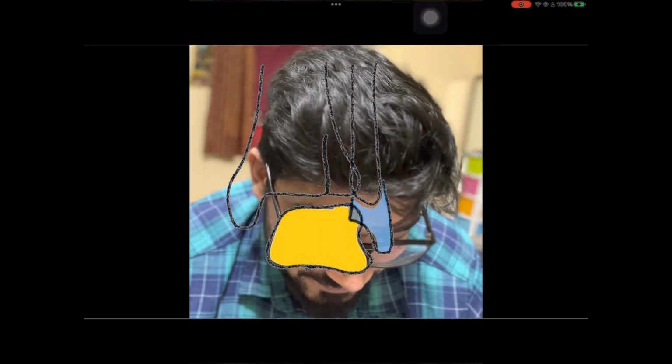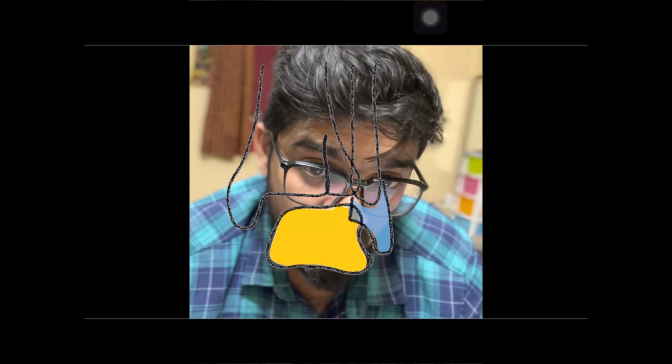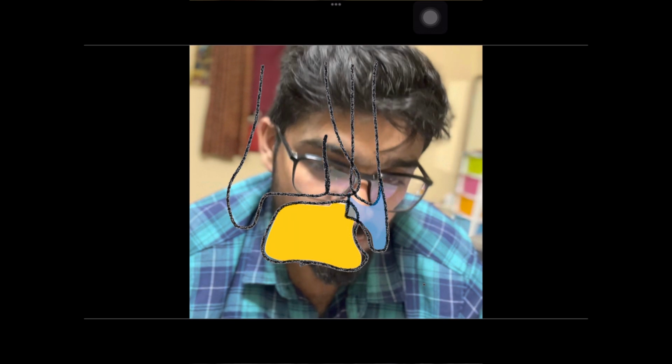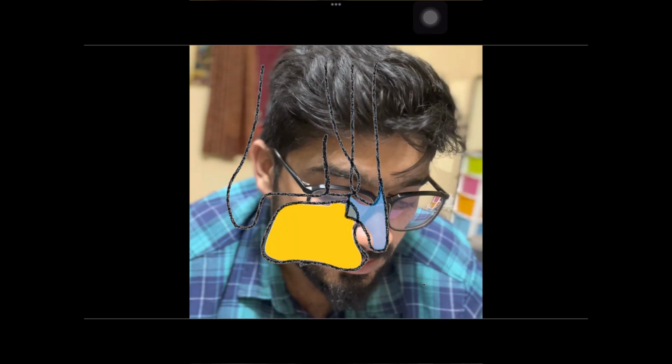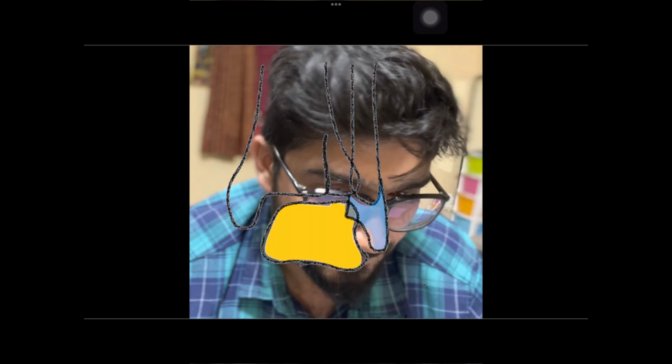Just look at the fibula fracture, the syndesmosis and the talus. We reduced the fibula, and the talus also moved because it is attached to the fibula by means of the ATFL. But still the medial clear space is increased and the syndesmotic space is increased.